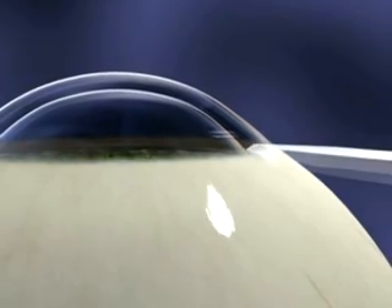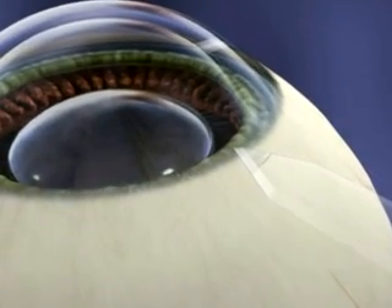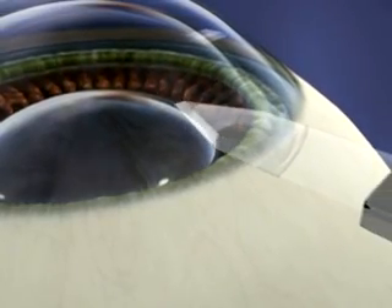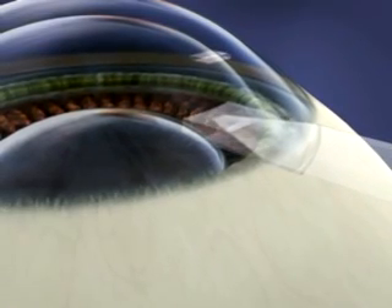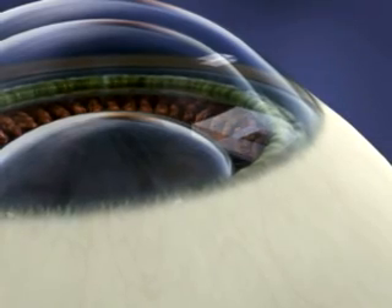When making the clear corneal incision, the temporal approach orients best to the iris plane. This prevents inadvertent touch of the crystalline lens. Using a knife you're comfortable with, make a slow and controlled entry. The clear corneal incision should have a cord length of 3 to 3.2 mm with a 2 mm tunnel on a parallel plane to the iris.